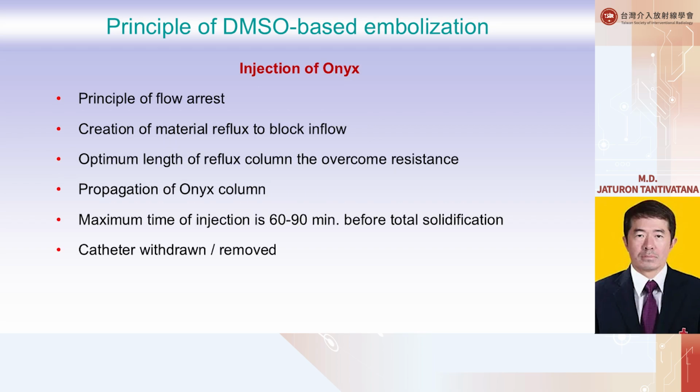The other principle is the principle of flow arrest, just like the injection of NBCA or glue: the creation of material reflux to block inflow, or just create a pseudo inflow arrest.